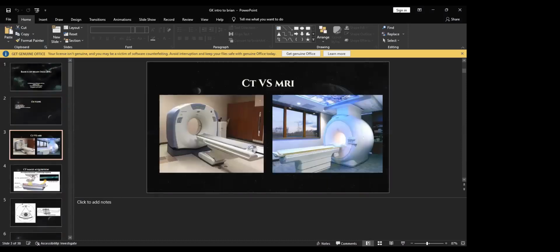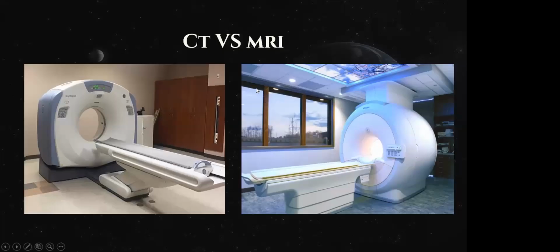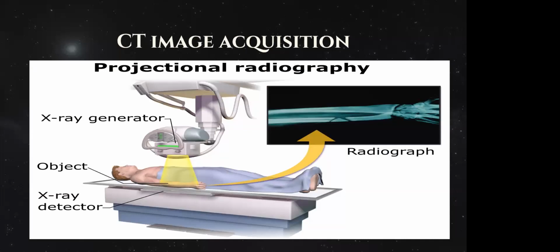Although I know most of you are already familiar with how CT images are created and what kind of different densities are shown there, so I won't go into details of the CT. I just want to tell you that CT imaging is an offshoot, or a very elaborate form, of X-ray imaging.